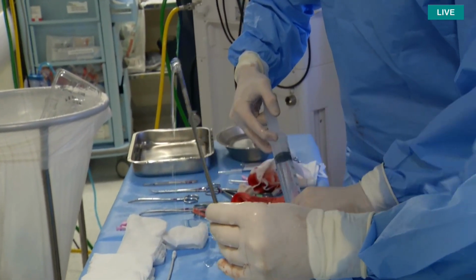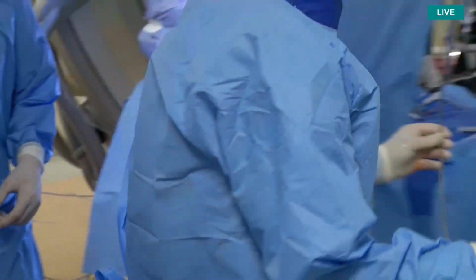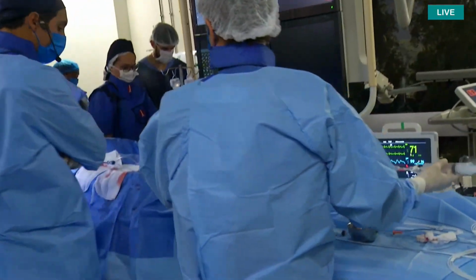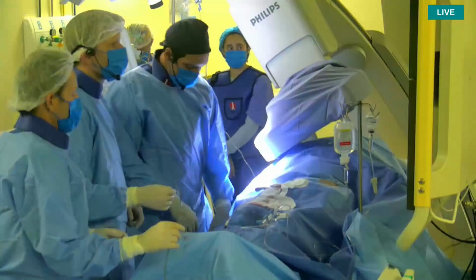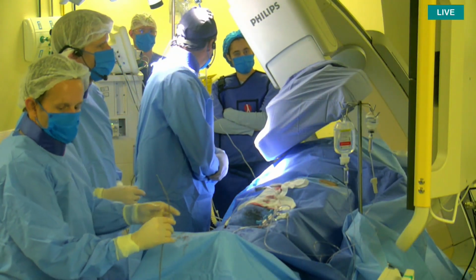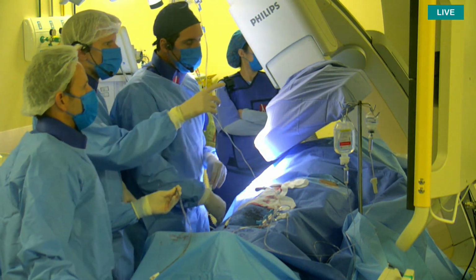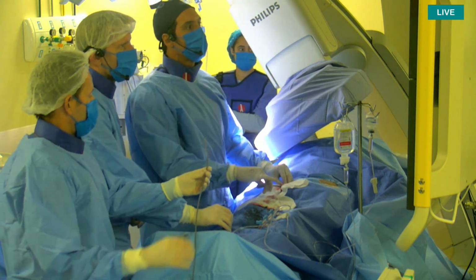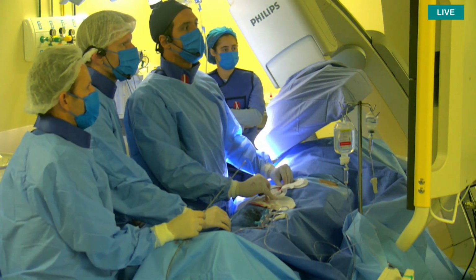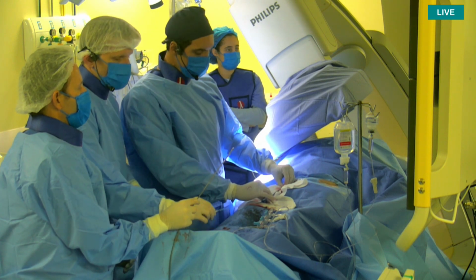Okay, I think we're there. We're good. All right, good. You take the device, Fábio. Be careful with the wire here. Be careful with the wires. Yep. All right, good. Let's go echo live. Then we can see. So Felipe, you can see I would push the device in the delivery sheath a couple of millimeters deeper, like 3-4 millimeters deeper, before pulling back the pigtail. Yeah, that's enough. Right. Okay. Good enough.